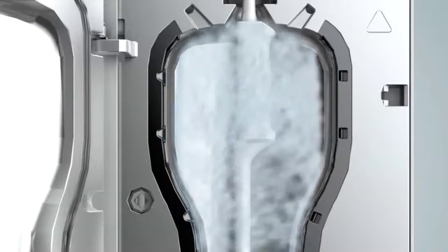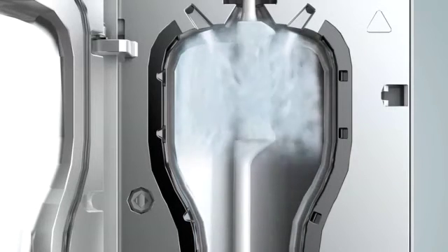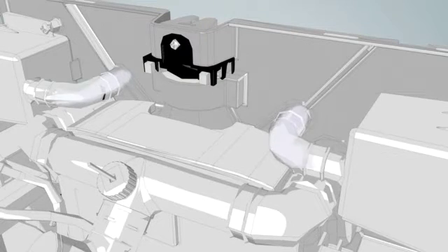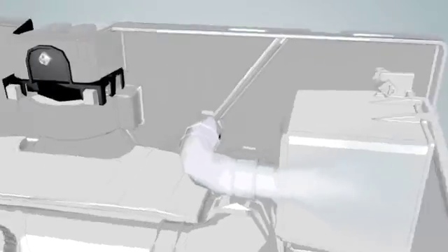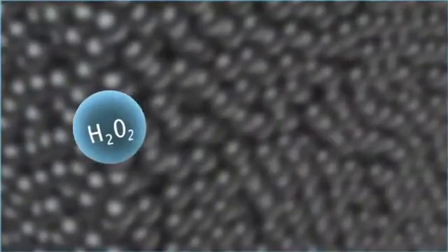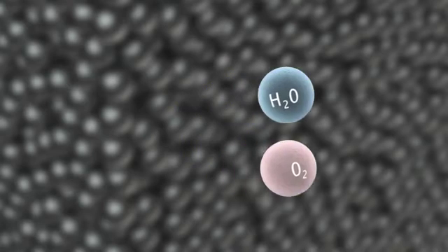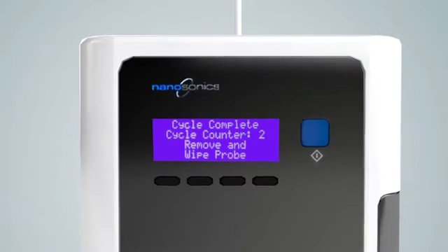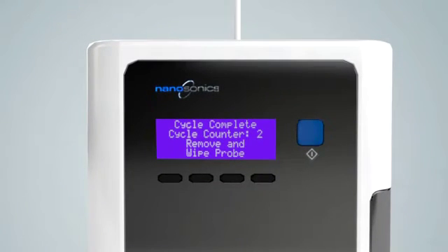After disinfection, residual hydrogen peroxide is blown out of the chamber and passes through destructors, where it is broken down into environmentally friendly water and oxygen. The TROPHON EPR's intelligent control unit determines that the disinfection cycle is successful.